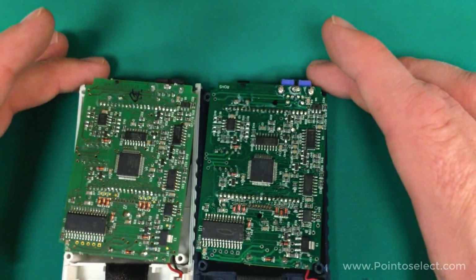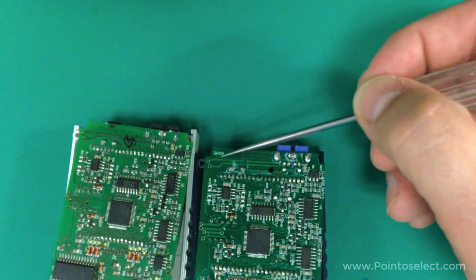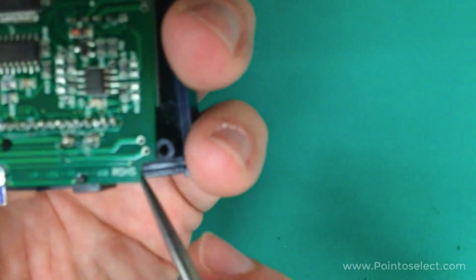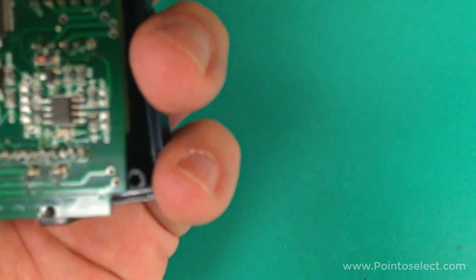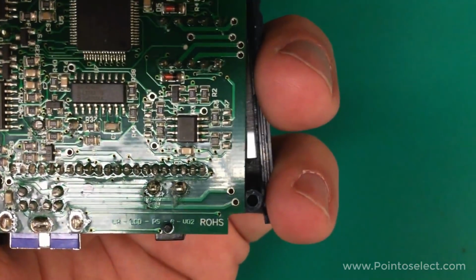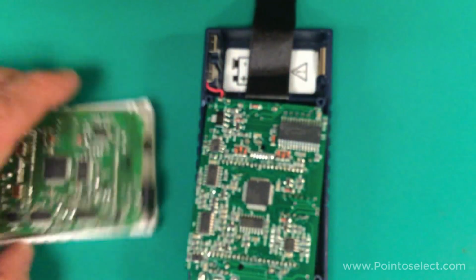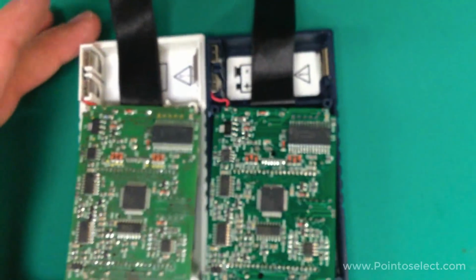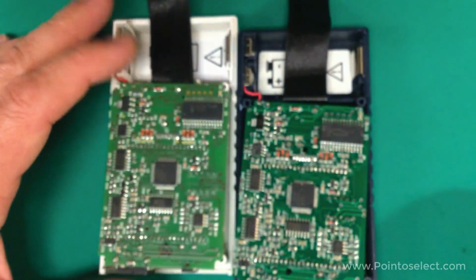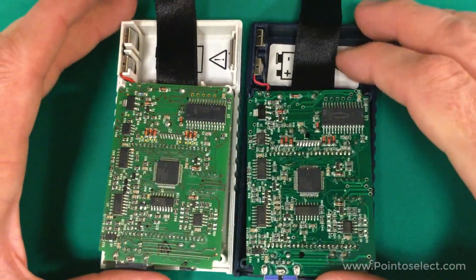I noticed that right here we have the RoHS marking, it's commonly called. See if we can focus that. And there we go. And that means that it is certified to be free of lead and toxic heavy metals. That's a European manufacturing requirement, and so I'm surprised the German one isn't marked that way, but undoubtedly it complies. It has to in order to be sold.